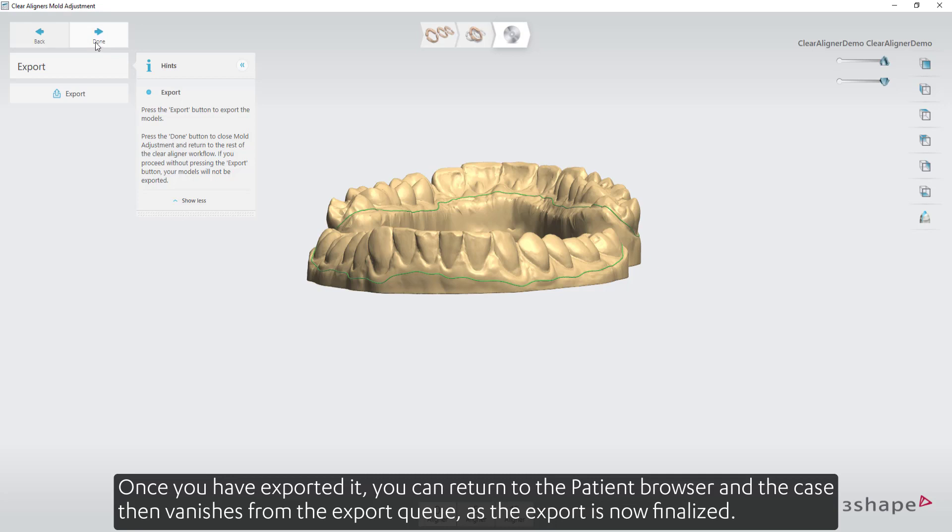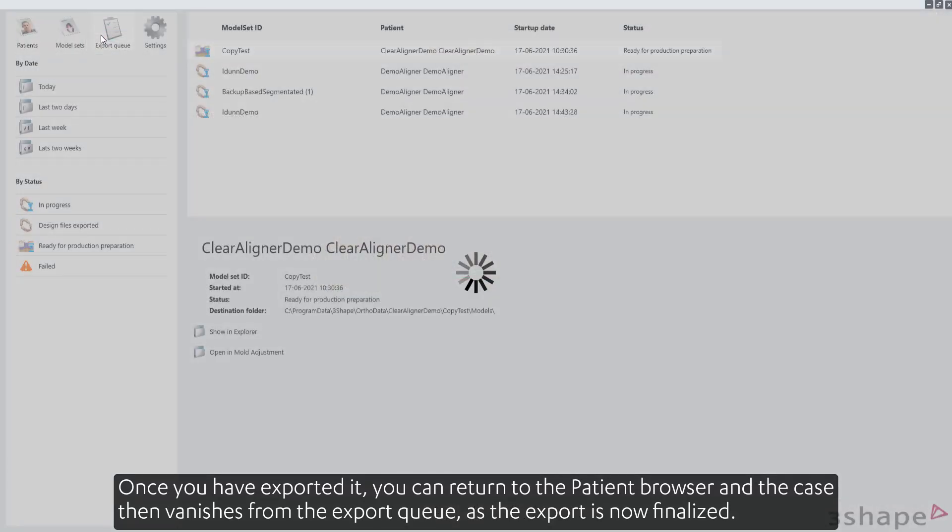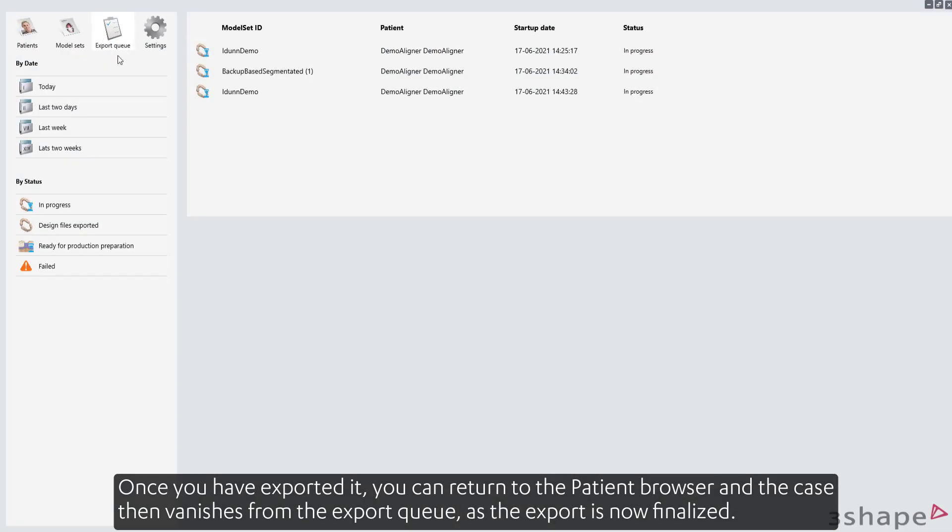Once you have exported it, you can return to the patient browser and the case then vanishes from the export queue, as the export is now finalized.